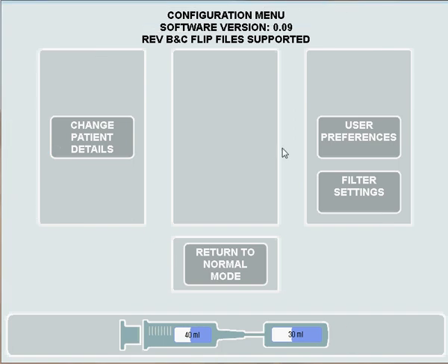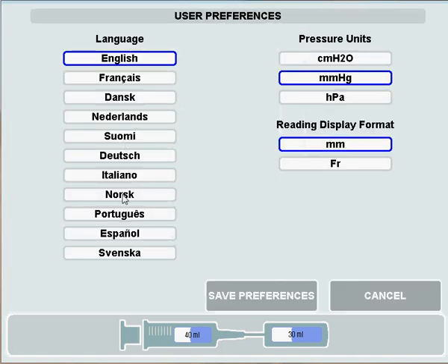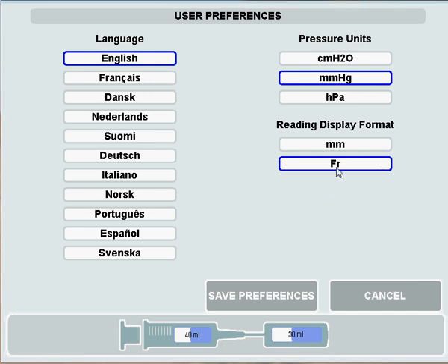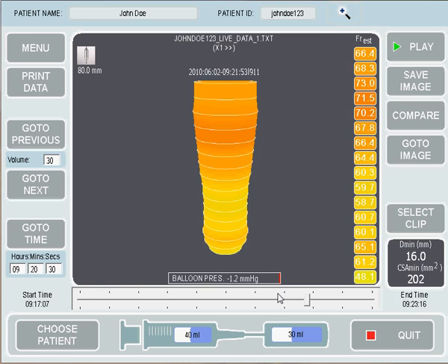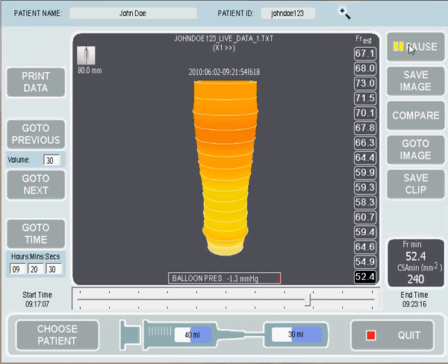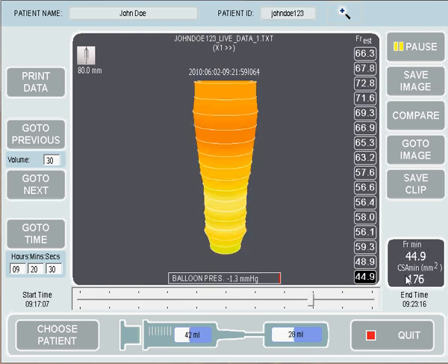Using the User Preferences menu, we can change the language of the software into one of the available languages, change the pressure units into any of the listed options, and change the readings to be displayed in either millimetres or French. If we make a change — let's say I'll change to displaying in French — we press the Save Preferences button, and when we go back to the main screen you'll see our image is now in French. Our D-min is now shown as French units and our cross-sectional area is still displayed.